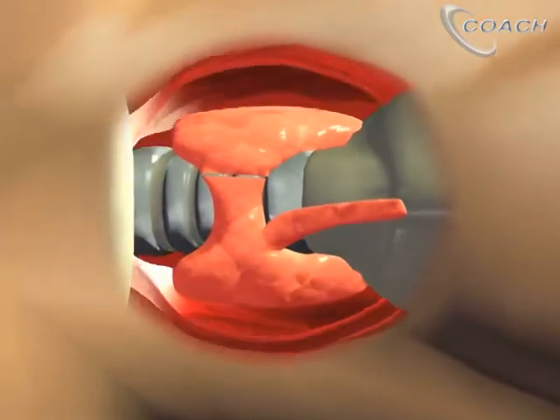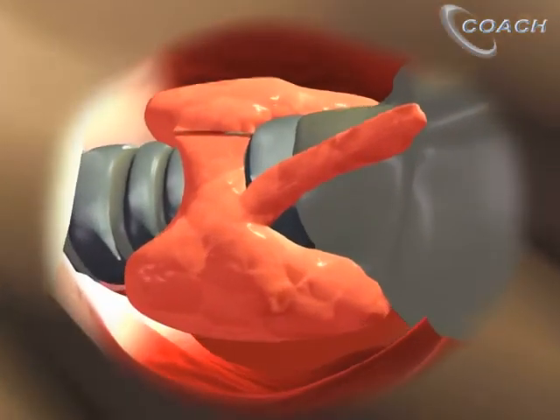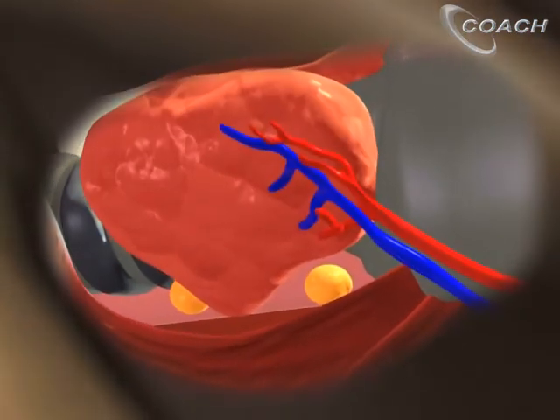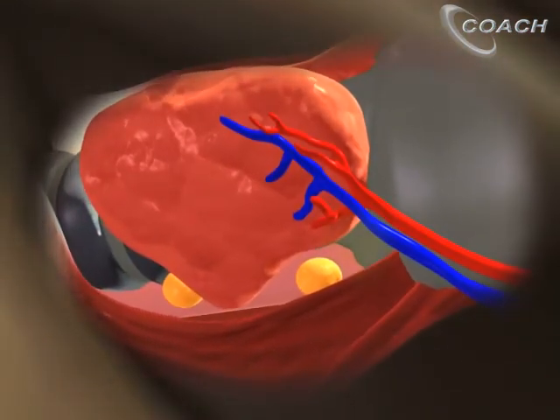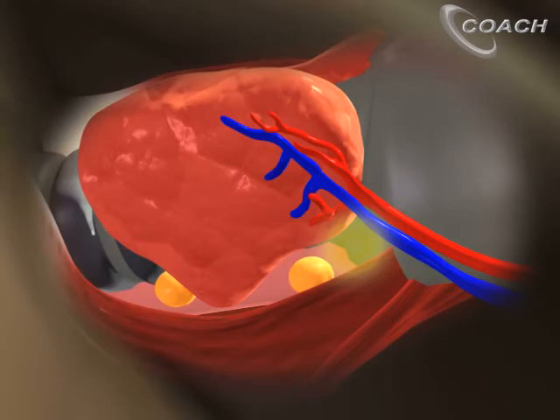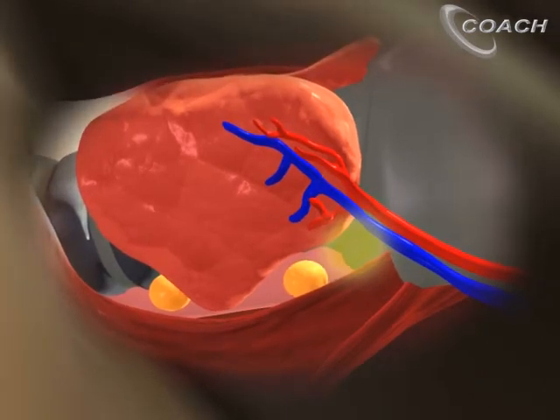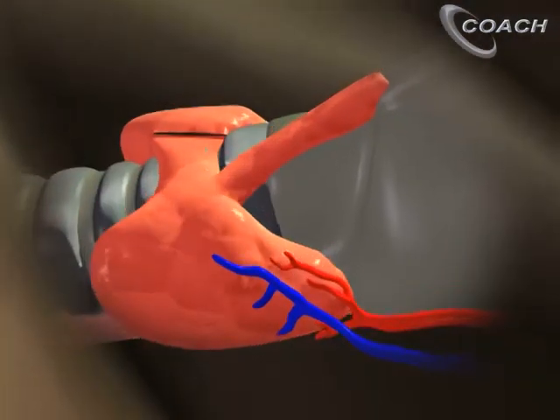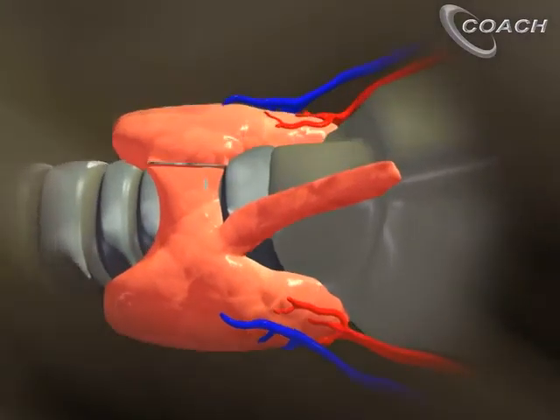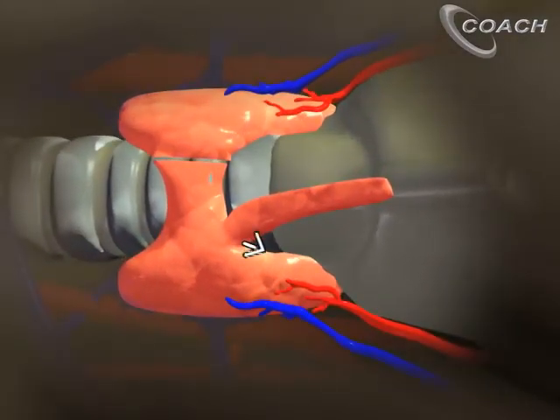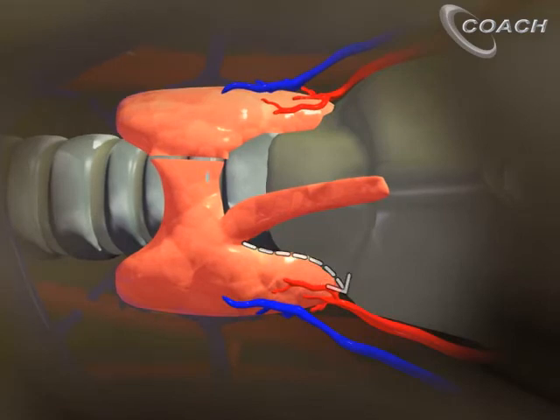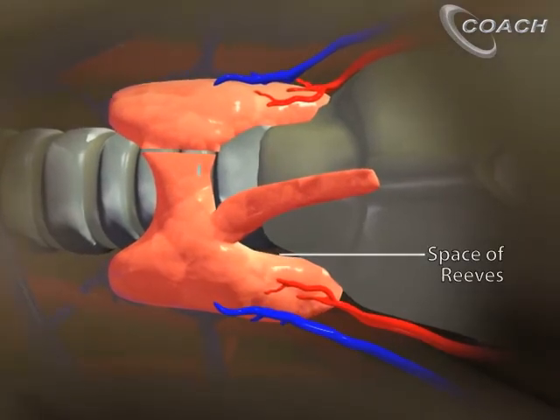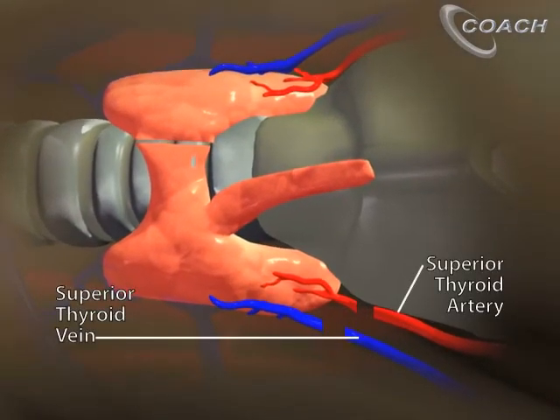Next we'll rotate the strap muscles laterally and pull the thyroid anteriorly. This will help us expose the clear portion beneath the superior pole of the thyroid and expose the lateral portion of the superior thyroid vessels. Next, we'll turn our attention to the space of Reeves and divide the tissue between the thyroid and the cricothyroid muscle to open the space of Reeves. Then we'll divide the superior pole vessels.